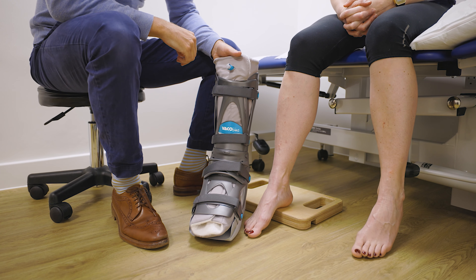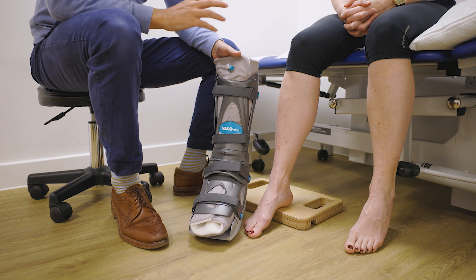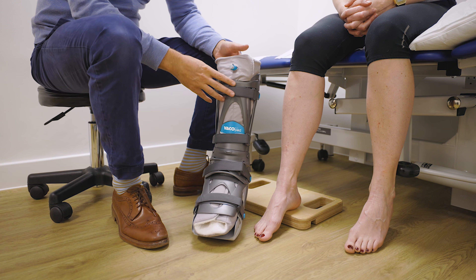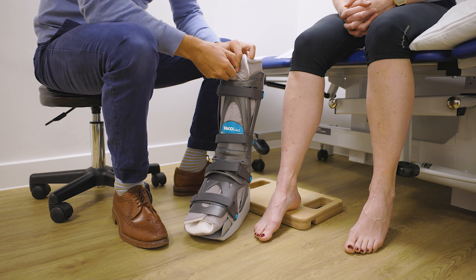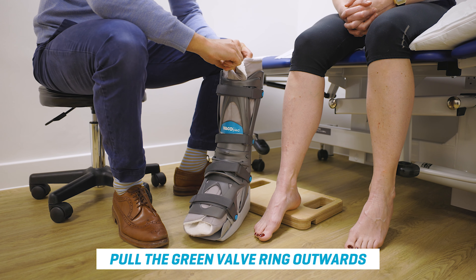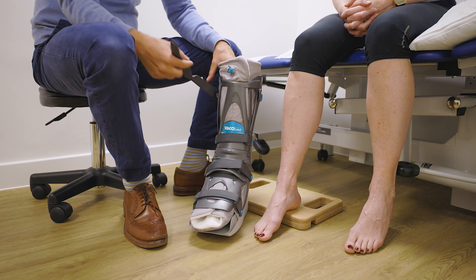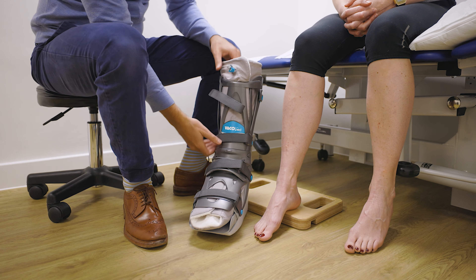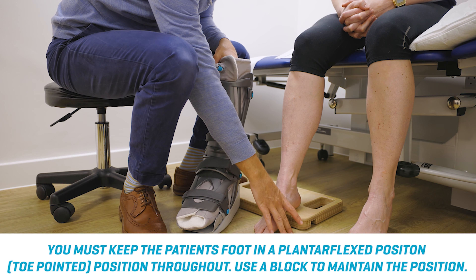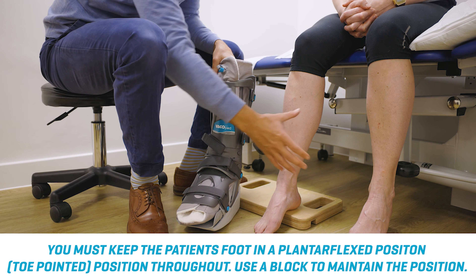You've probably been put into the VACO-PED already, but at points throughout the rehab process you are going to need to take it on and off. In that initial phase, it's so important — even when you're asleep — to keep your foot in that plantar flexed position. To put the boot on, the first thing to do is make sure that the valve is open: pull that open and squeeze it, pulling it towards yourself so that bit of plastic comes to the end. Next, open the straps. You can see we've got the foot in that plantar flexed position — we don't want that heel going down to the floor in those early stages because we don't want to lengthen that tendon.